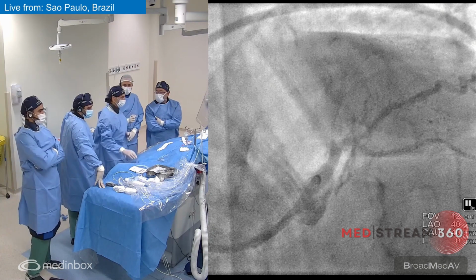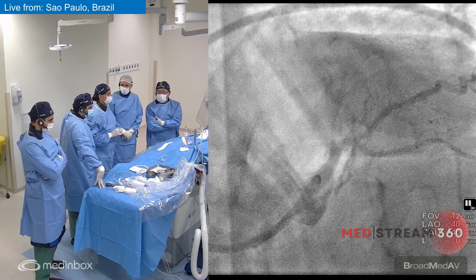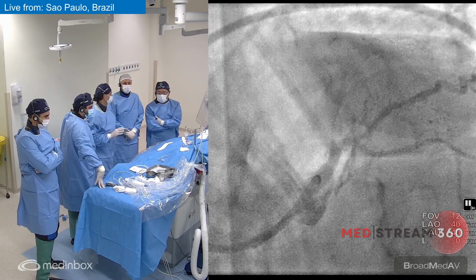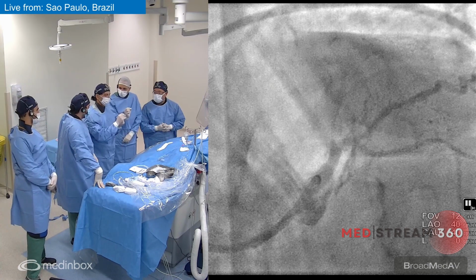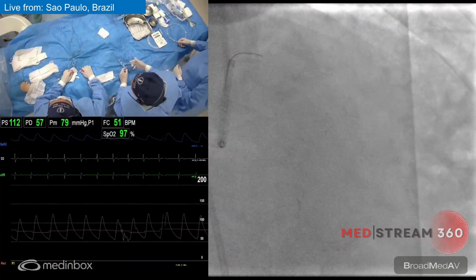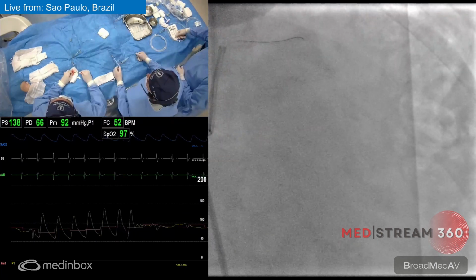Yeah. And what's the weight of the tip of this wire? About 2.7, right? 2.7. So you think it's good to start with first? It's perfect. For this case, it's okay. So what are you going to do now, Louis? About 45 degrees minimum, the very, very tip. You could have the angio in the larger size and have the operator's view in a smaller size. Okay, so what are you doing now, Louis?